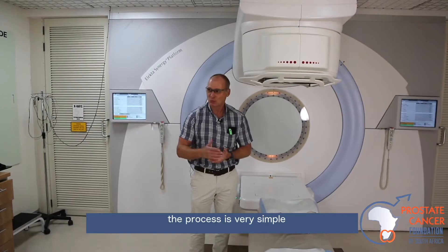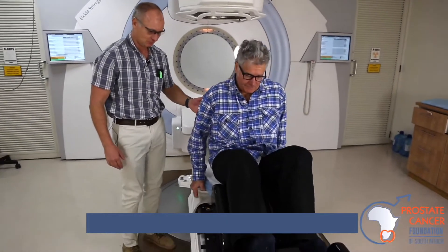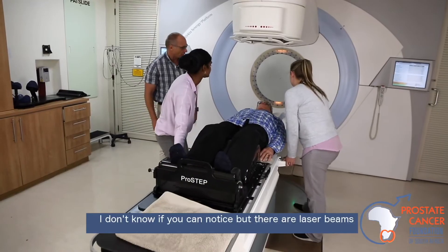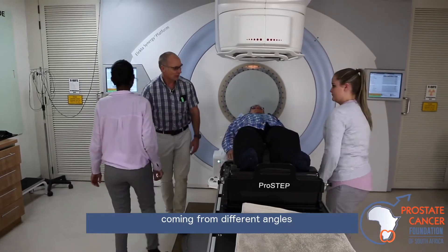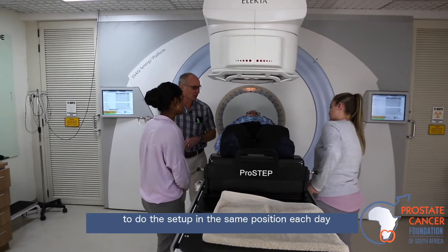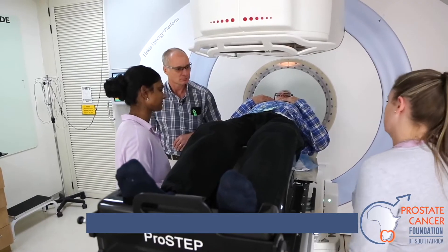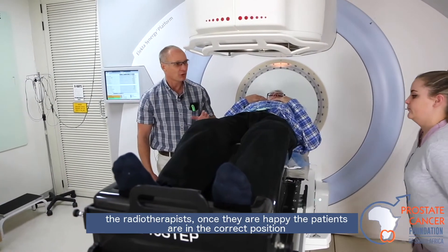We have our patient, and the patient needs to lie on the bed. The radiotherapist would then position the patient in the correct position. There are laser beams coming from different angles that we can use on the patient to do the setup in the same position each day. The patient would then be set up with the beam aimed at the prostate. Once the radiotherapists are happy that the patient is in the correct position, they would leave the room.